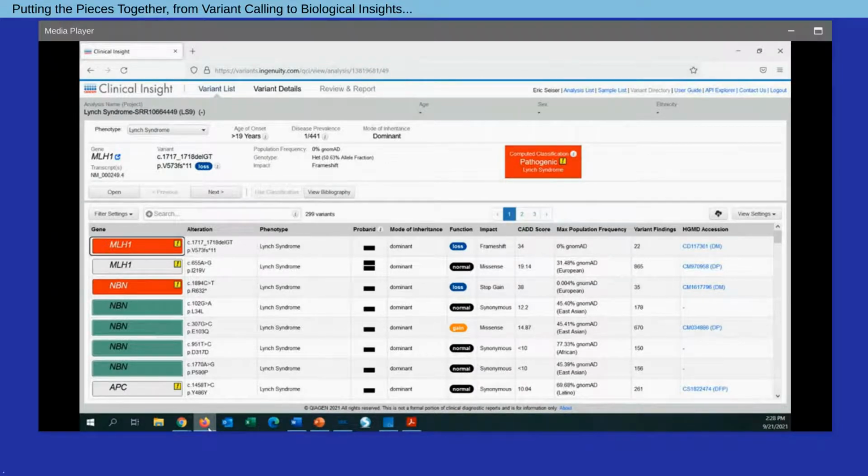It takes a couple of minutes to set up and run. Once it's run, our key set of results, again, at the bottom of the screen here, represent this table of variants that have been filtered and prioritized. So for each variant, we'll have a row of information with the c. dot, p. dot nomenclature, the phenotype that's most associated based on the information we've curated in the knowledge base. You can see there are a number of variants here associated with Lynch syndrome.